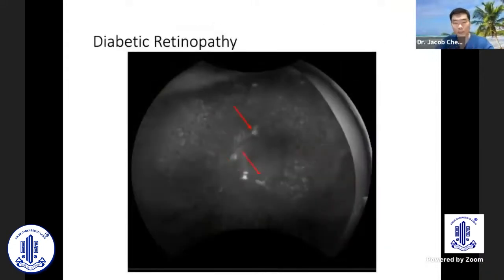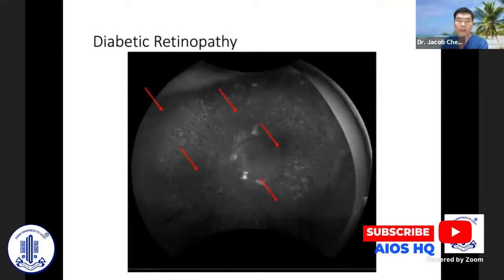On the opposite eye, the pre-retinal membranes have been highlighted on the green channel or the green laser. Also, in an institution like ours, we want to show the residents the areas of insufficient or deficient laser that can be topped up in this patient using the green channel.